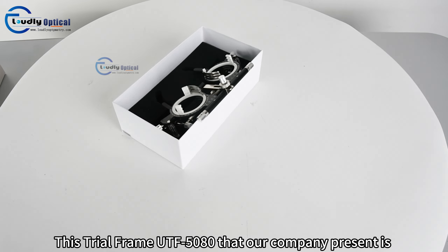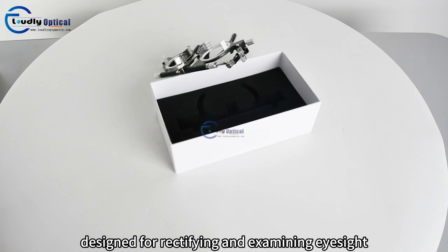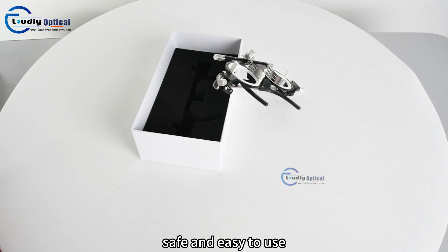This trial frame UTF-5080 that our company presents is designed for rectifying and examining eyesight. Reasonable, safe and easy to use.